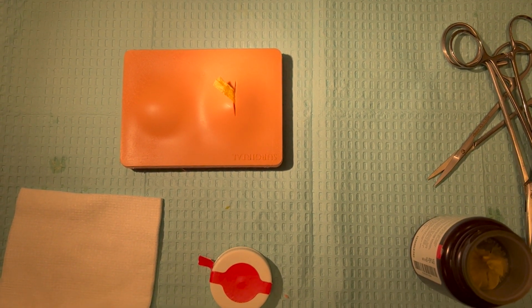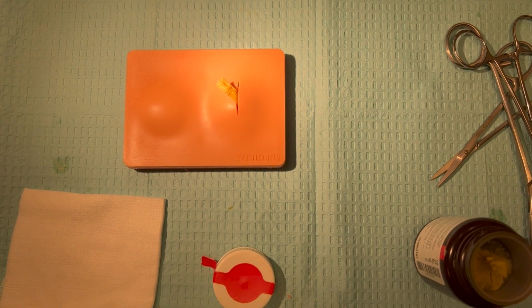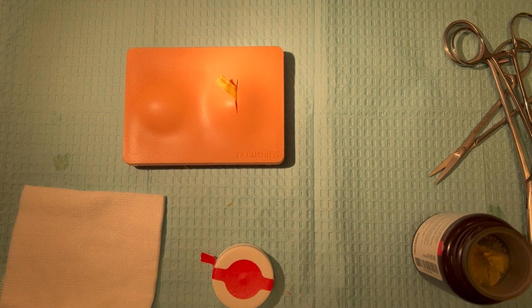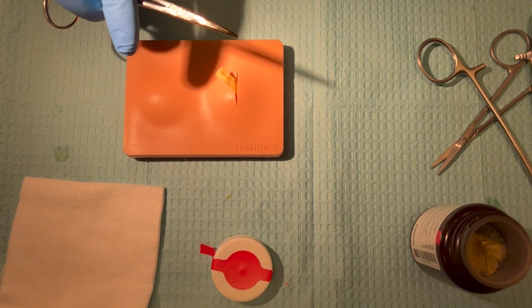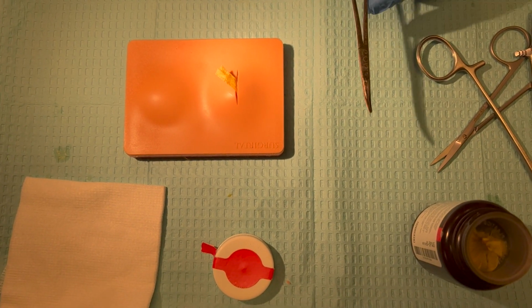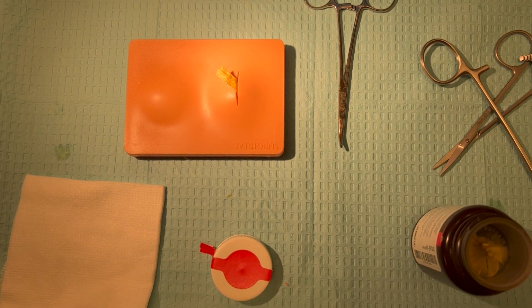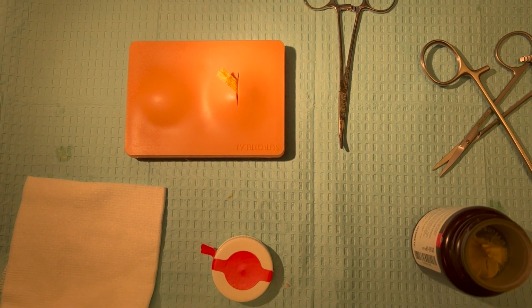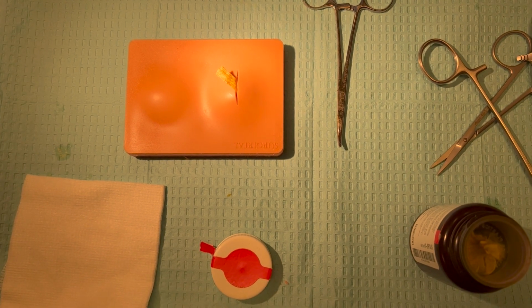Pain is something that we want to keep into consideration as a relative term because this is an uncomfortable procedure that's performed. Keeping in mind we made an incision into the skin, we probed this area with our curved hemostats. That alone can increase discomfort, especially as our numbing medicine wears off. Packing can increase discomfort as well. And so this is another reason why we want to be mindful not to overpack this area.